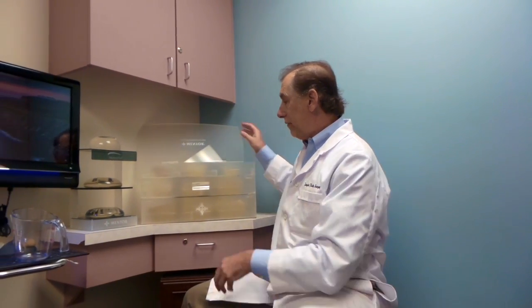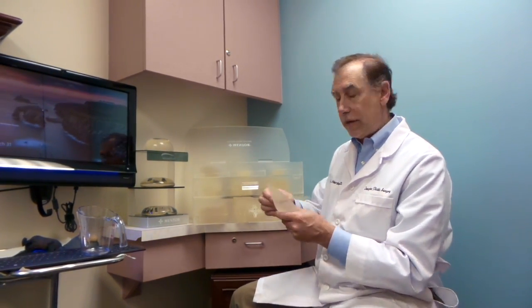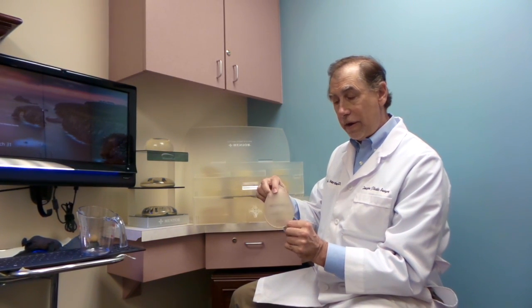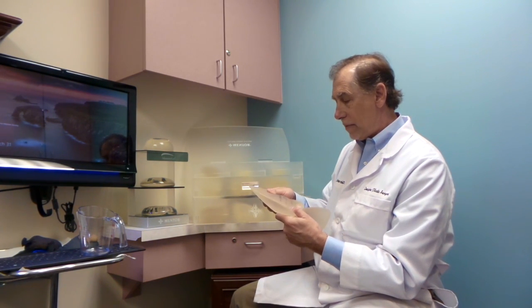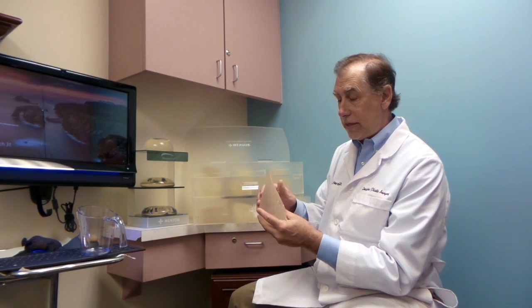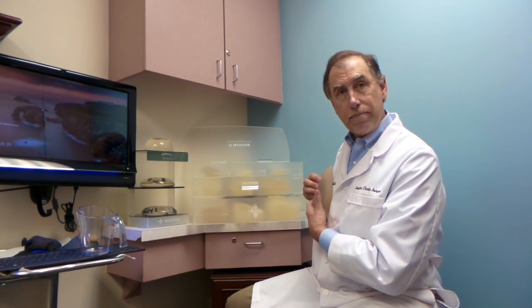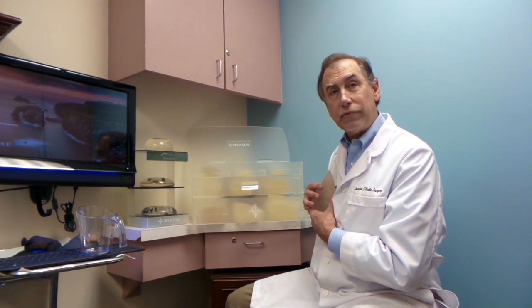If you come into our office, what we do here is we lovingly call this our treasure chest. These are not the shapes, but they're specifically designed for size. For instance, this is a 150 cc implant, and this one here is a 550 cc implant. So if you wanted to be 700 cc's, we put the smaller one in here, we put this in, and then we have stretch bras and blouses that you would put on to take a test drive. This is a little bit more accurate than the rice trick, but the rice trick works very well.